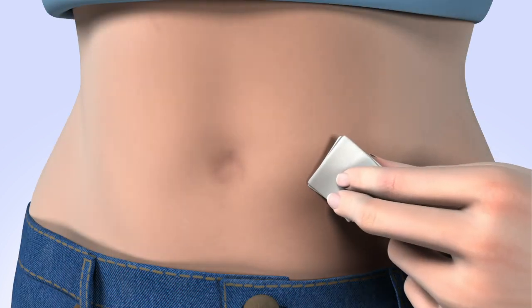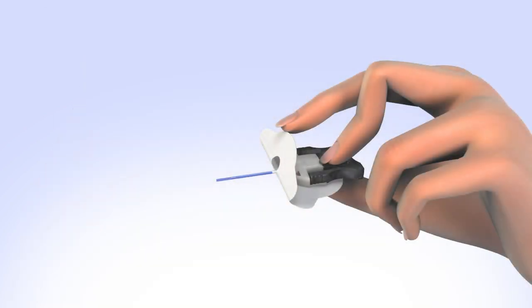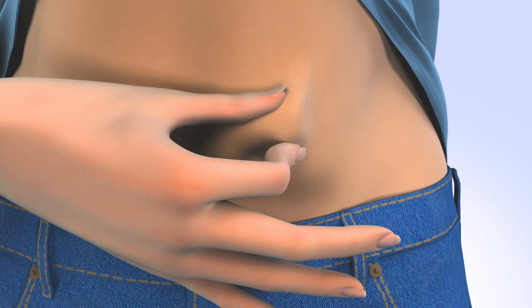Clean your infusion site properly with an alcohol wipe or prep wipe. Allow your site to air dry. Hold the insertion piece with your thumb and middle finger. With the index finger, flip the front portion of the adhesive back and hold. Remove the needle guard. With your hand, pinch the skin at the site you have prepared.